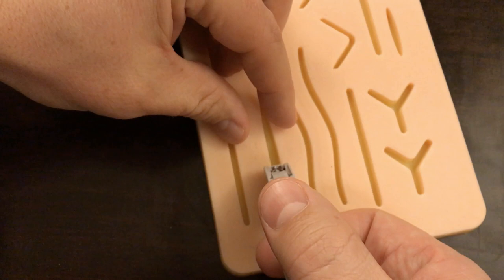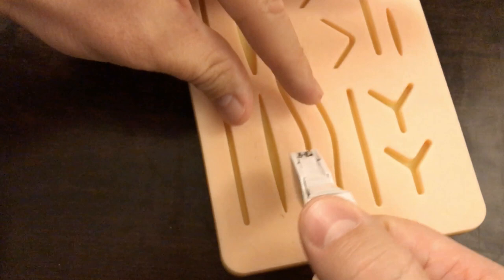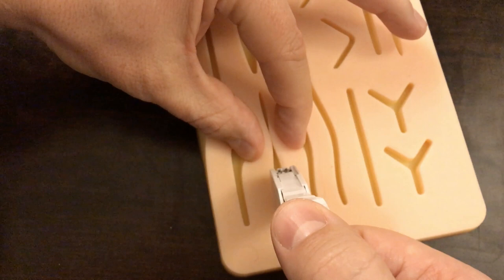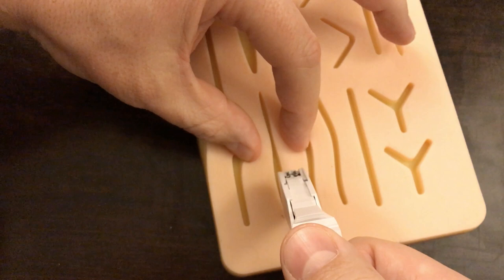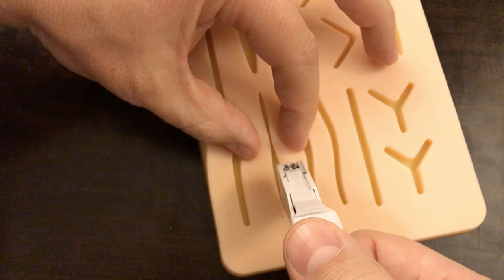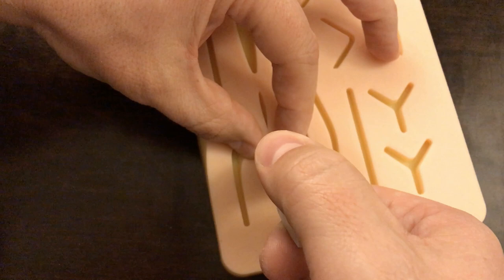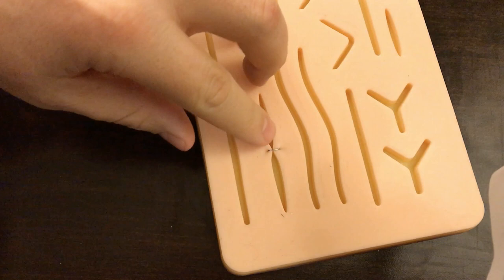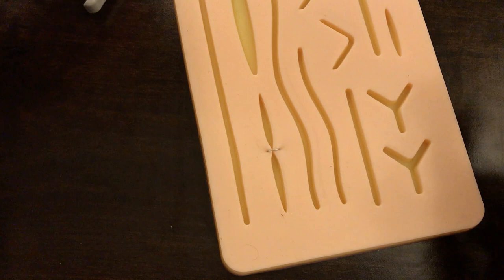The angle here is a little difficult, so let's say this is our laceration and I want to close this one. Oftentimes, especially if it's gaping a little bit, you want to start in the middle to take some of the pressure off. Use your fingers to cause the skin edges to approximate, and I like to make sure I'm applying pressure outside of the skin edges so there's eversion at the skin edges. Then place the stapler firmly on the skin and press firmly to place the staple — as you can see, it approximates the skin edges in that spot.